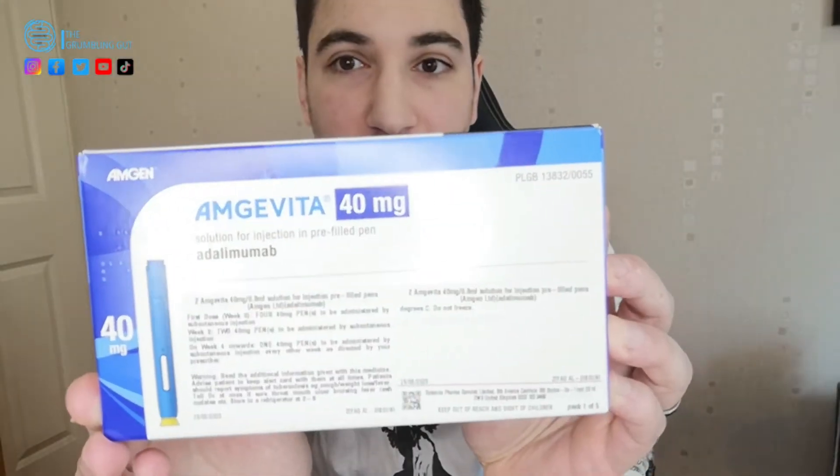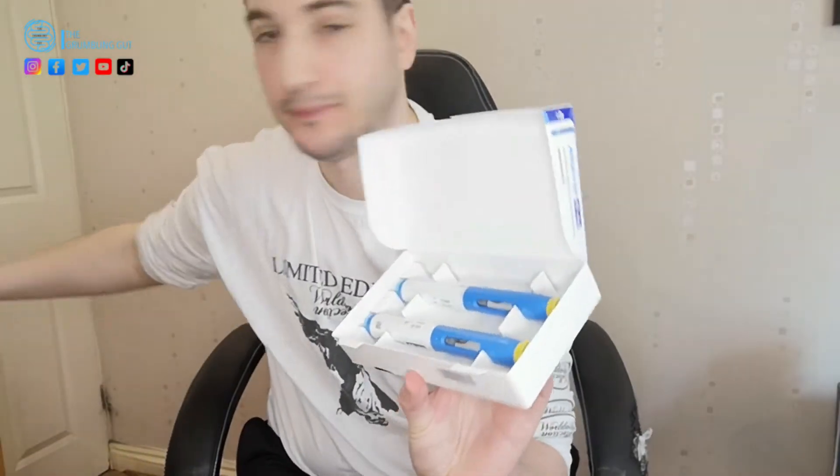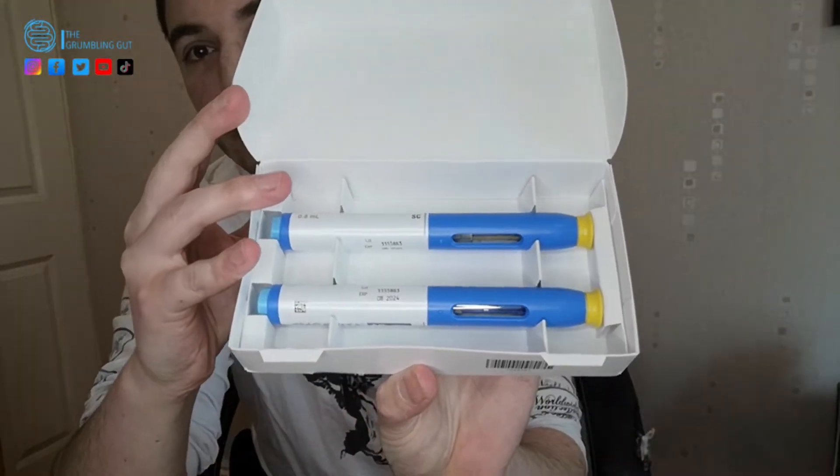Amgevita. This is the biologic I'm taking. You can see it comes in a little box like this. It's pre-filled syringes. Just to show you what it looks like inside — got the instructions. That's what it looks like inside.